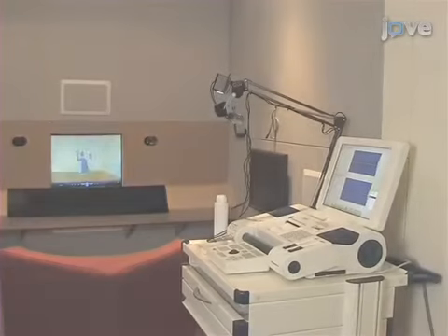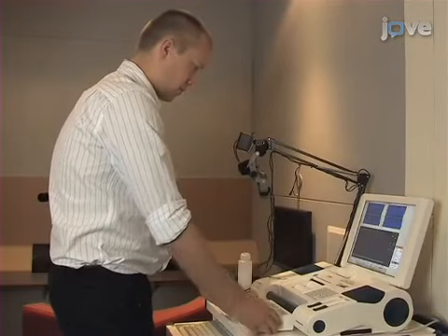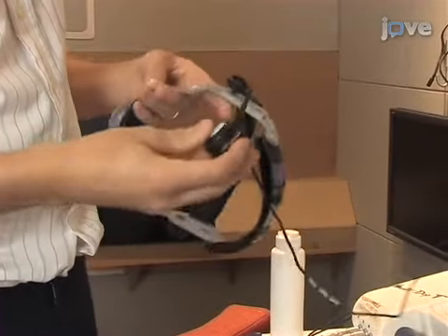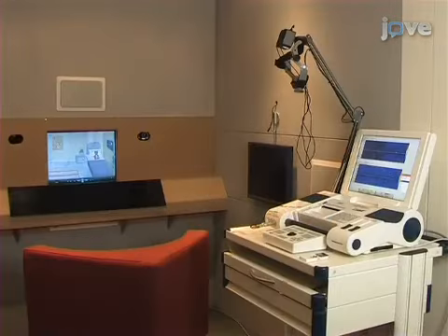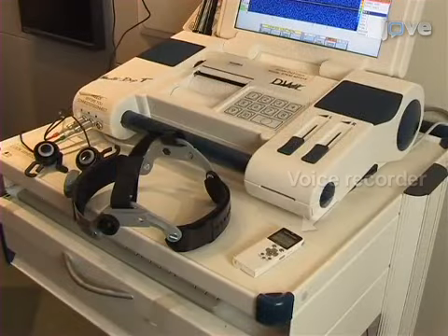Demonstrating the procedure will be Georgina Holt and Nick Badcock, a research assistant and postdoc from my lab. This video will demonstrate the use of functional transcranial Doppler ultrasound, fTCD for short, to assess language lateralization in children. The system consists of a multi-dop with ultrasound probes attached to a headset, a stimulus computer that will be used to show videos to the subject, and a voice recorder for auditory responses.